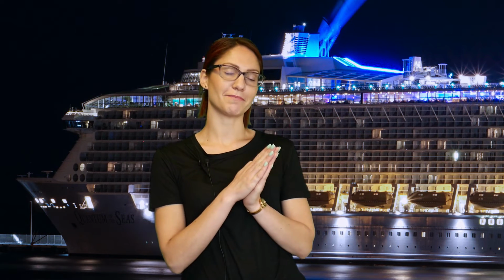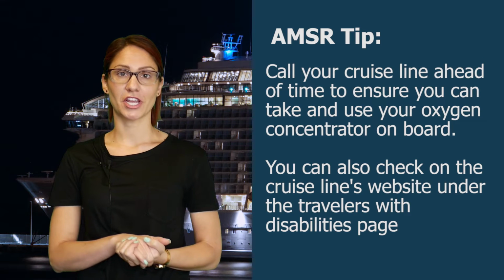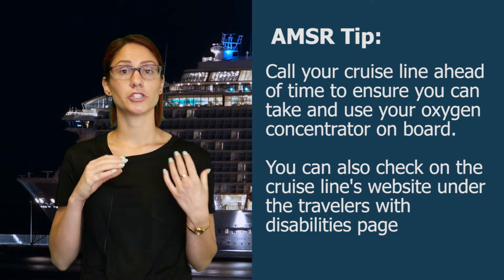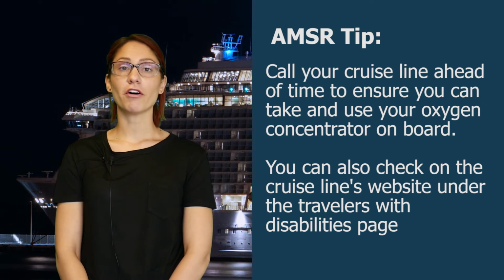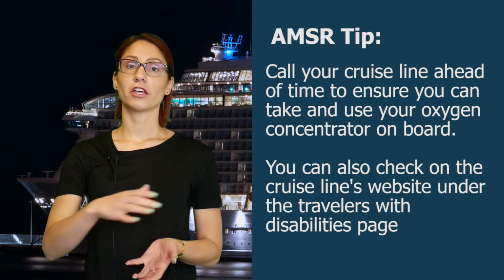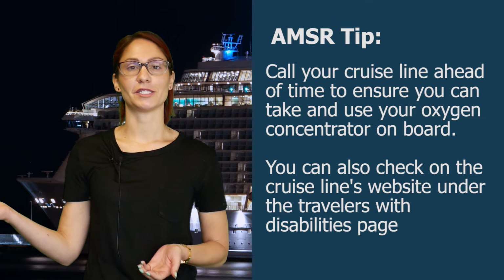Okay, lastly, we're going to talk about cruising, my favorite type of vacation. So if you are cruising this summer with oxygen, make sure that you check with your cruise line's onboard oxygen policy. You can usually find all the information you need on the cruise line's website. You just want to look under the Travelers with Disabilities page.